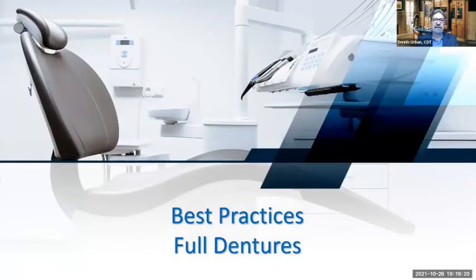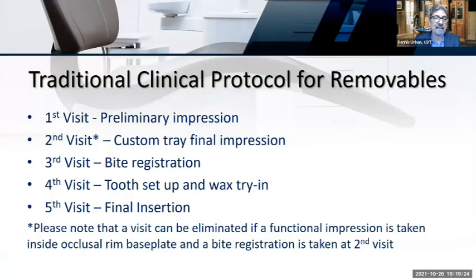So let's talk about the best practices on full dentures and the traditional way of doing things. Well, traditional clinical protocol for removables is about 5 visits. And we talked about that earlier. We touched on that. And the first visit is a preliminary impression. Second visit, we make that custom tray so you can get that final accurate impression. Then we'll send a bite registration for occlusal records for the third visit. And that fourth visit, we're going to send you a tooth setup with the wax try-in. And the fifth visit is you do that final insertion.